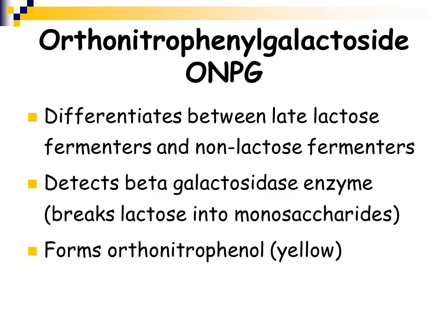Now, ONPG is another test, and this will allow you to differentiate between late lactose fermenters and non-lactose fermenters. What this test does is detect the enzyme beta-galactosidase.